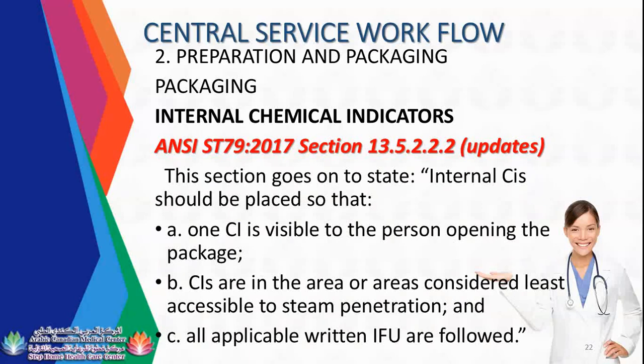As per the new updates again, the internal chemical indicator should be placed so that one chemical indicator is visible to the person opening the package. If I am the nurse and I will use this instrument, I need to see firsthand, outside the pouch, that this instrument was exposed to steam or in the autoclave. That's the reason why the chemical indicator should be placed next to the instrument.